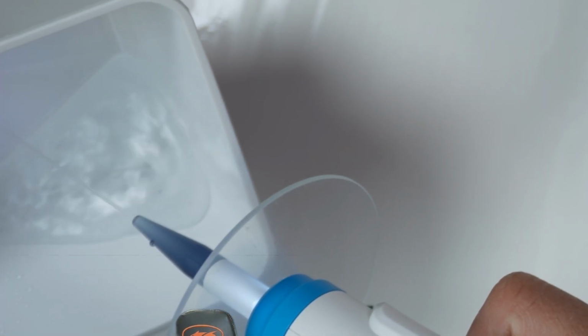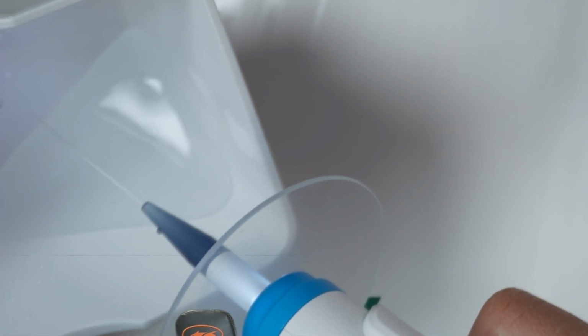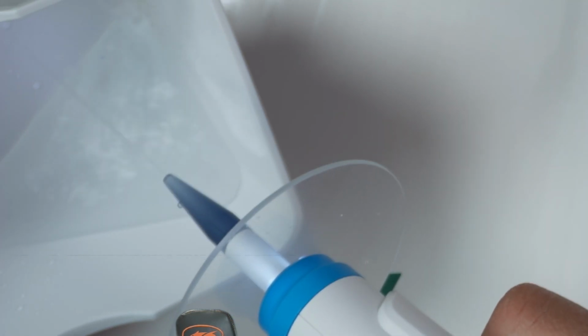This is one mode first. We're going to do a real quick one. And it sprays a little bit, all right? Now we're going to change it to a different mode, number 2. A little bit faster. And then we're going to go to number 3. You could hear it on there. And then we go to the last one, number 4.